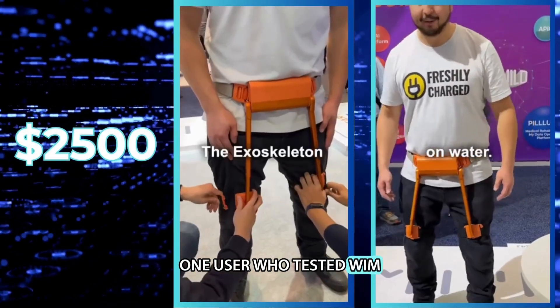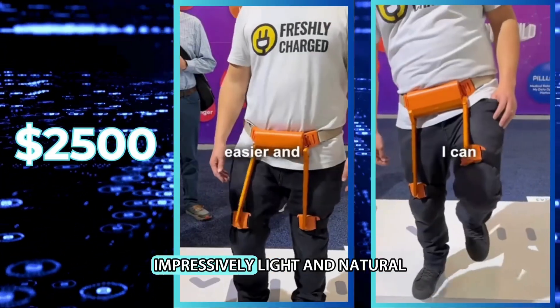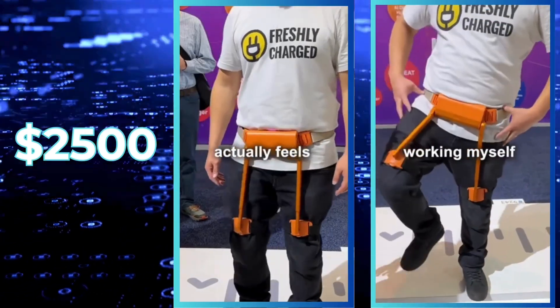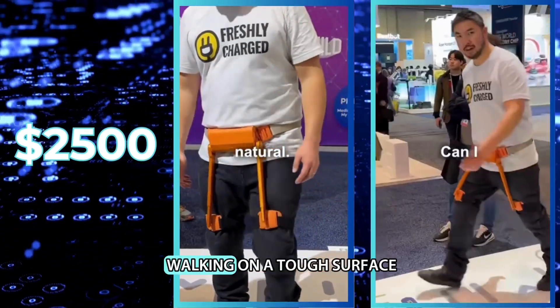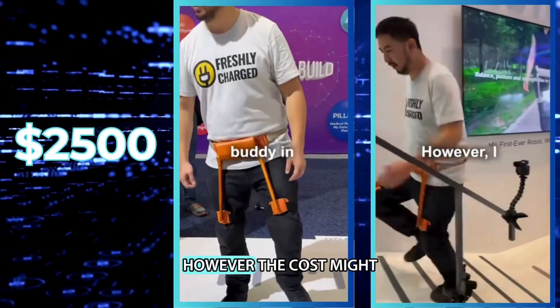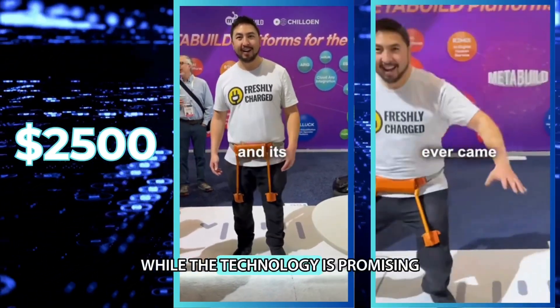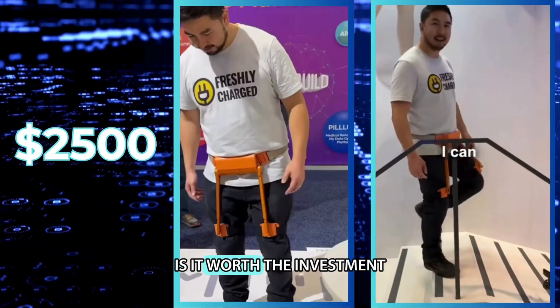One user who tested WIM, despite its $2,500 price, found the robot impressively light and natural. They compared the exercise mode to walking on a tough surface — great for those who want a more challenging workout. However, the cost might be a barrier for some. While the technology is promising, is it worth the investment?